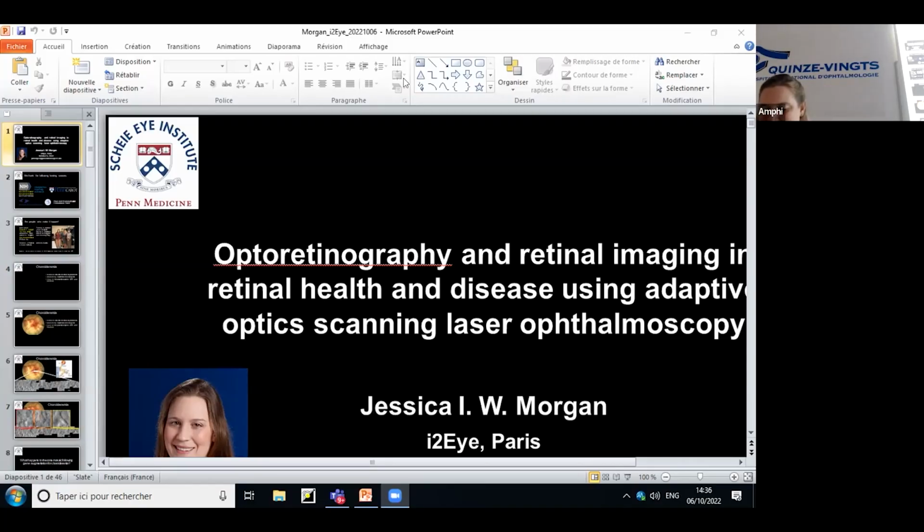So good question. And have we compared ERG signals between these patients and control subjects? Oh, well, it's also a really good question. We really want to do this because it begs to be done in terms of comparing, in particular, the A wave of the ERG with the optoretinogram measurements. We haven't done it yet. It does become a little difficult when you start thinking about this. A classic ERG will sum up signals across the entire full field of the retina. So for instance, our choroideremia subjects will just have a flat ERG. They don't respond on it because their central island is so small in comparison to the periphery, which is just full loss of photoreceptors. So we want to do that.